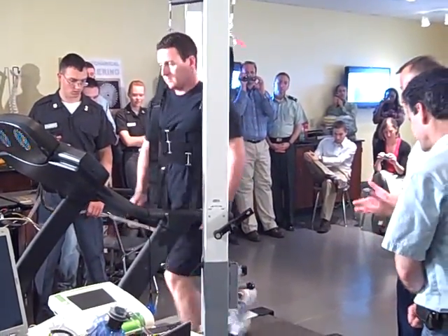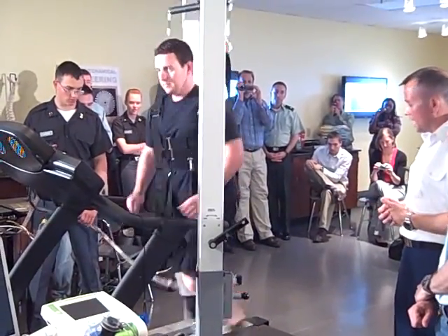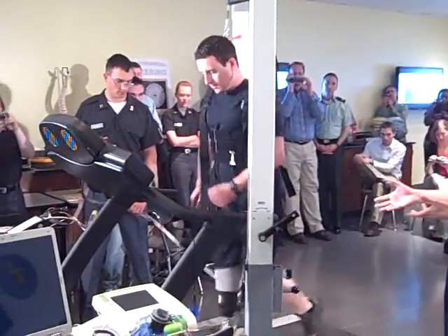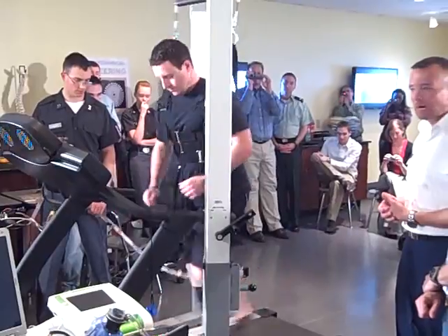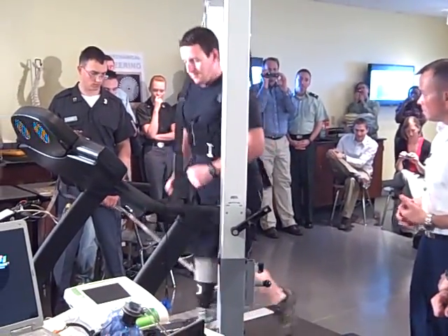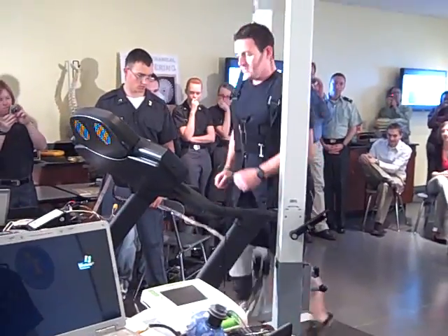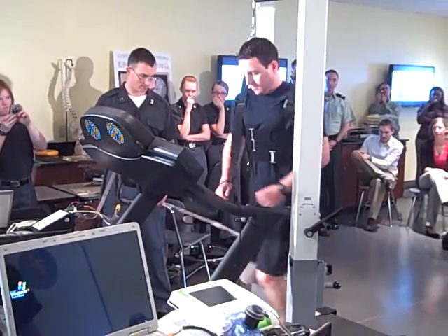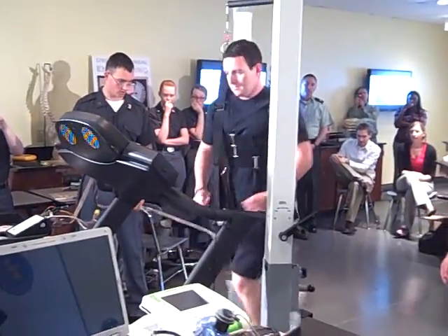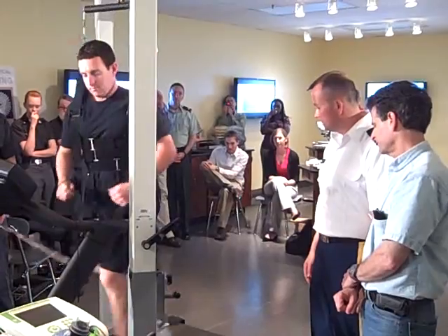This is the first motorized prosthetic ankle for running. It is delivering right now from the motor about 600, 700 watts. The system is delivering about 900 watts.